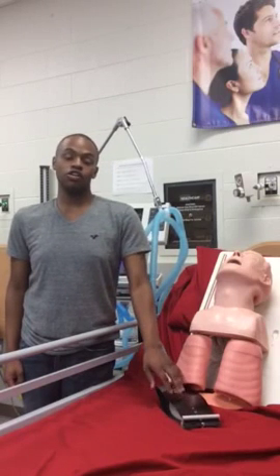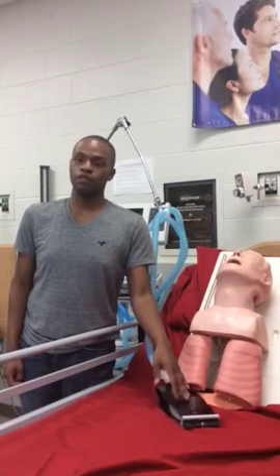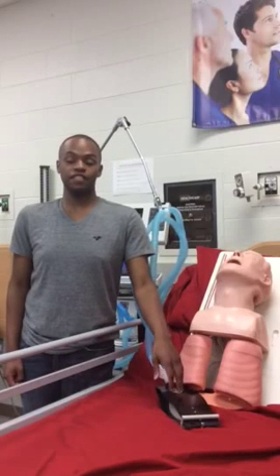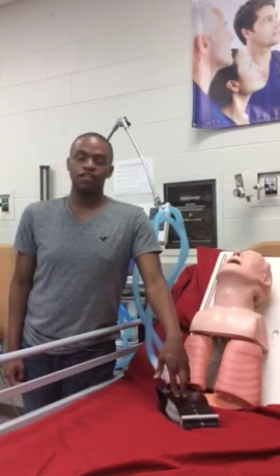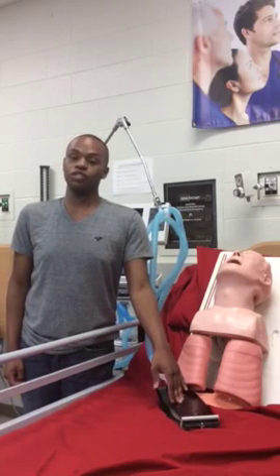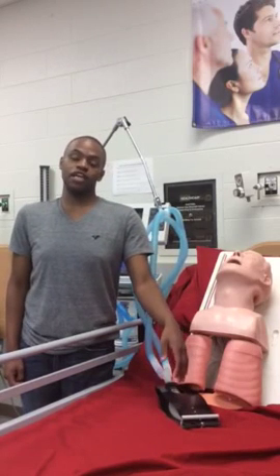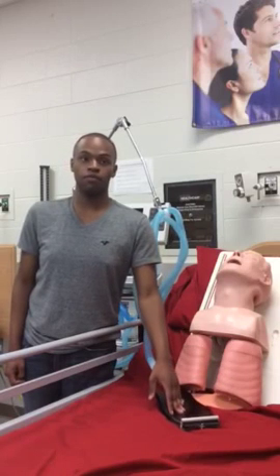I can now calculate her Tobin index. I take the frequency and divide that by the tidal volume. So I take the 14, divide that by 250, and I get 56. We want the Tobin index to be less than 80 to 100. This Tobin index helps us to see if our patient is breathing too rapid or too shallow. If it's too rapid, she's going to tire out. If it's too shallow, she's going to build up her CO2, and we're going to have a big problem.